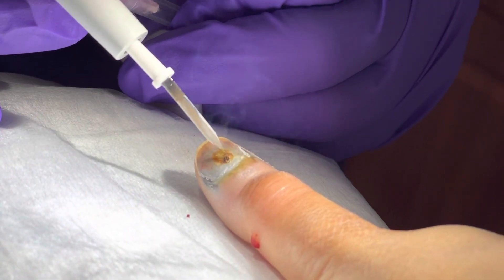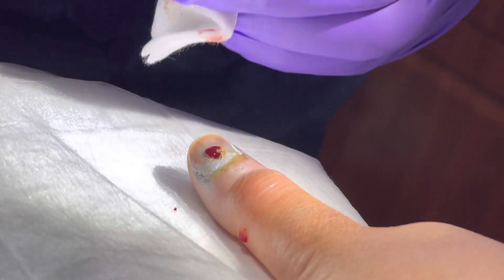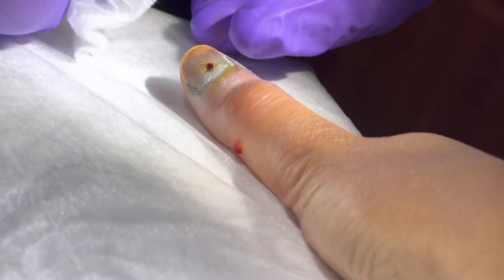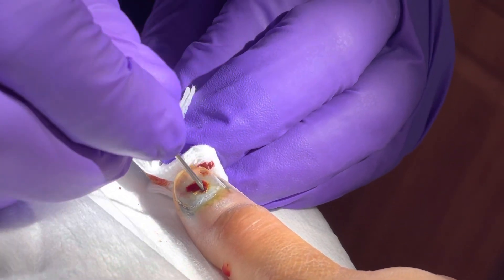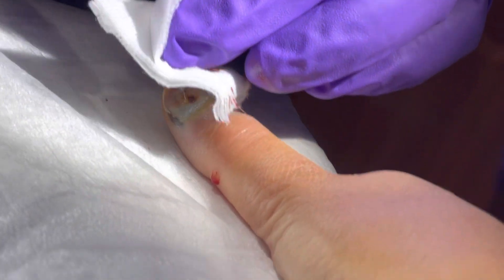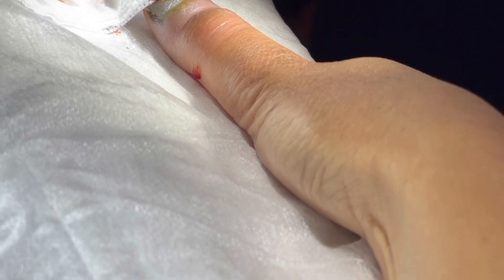How are you feeling? I'm about to pass out now. Oh look, there's a bunch of light on that. That smell — Dinagoan. It smells like lechon. Burning hairs. So we'll let that release its pressure for a bit, and then we'll just put a bandaid over it.